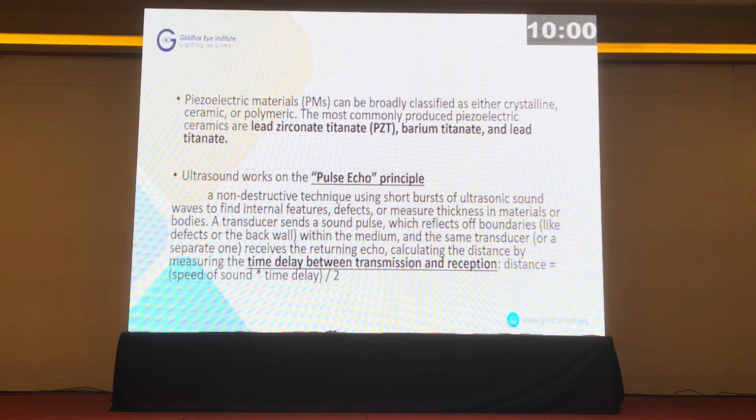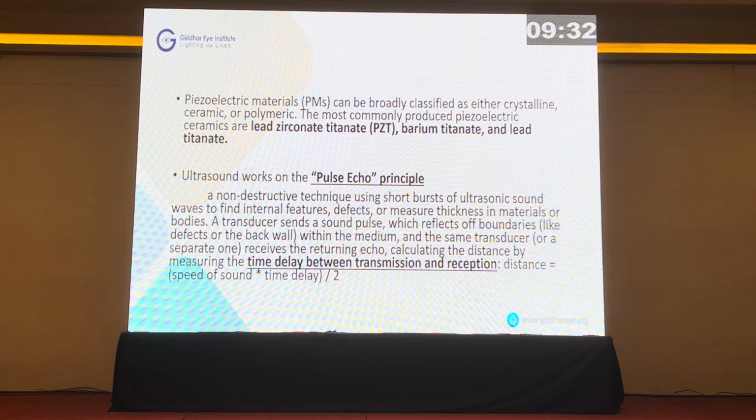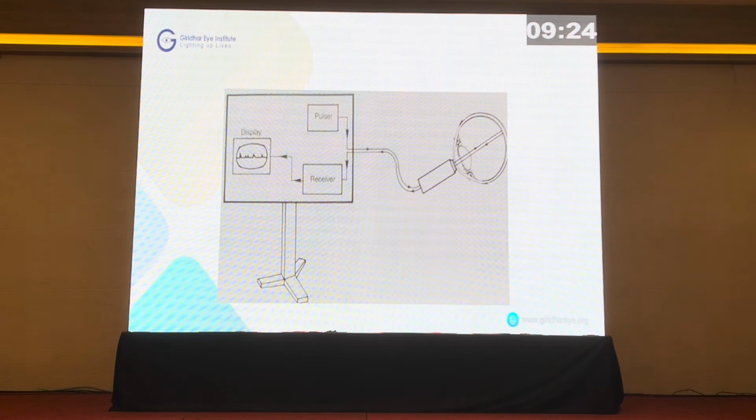The initiation of the signal starts with the use of piezoelectric materials, which most commonly used are lead zirconate titanate, barium titanate, and lead titanate, and it works on what is known as the pulse echo system. It locates a particular lesion inside the eye based on the time delay between transmission and reception. It is something like the Michelson interferometer, but instead of light, it uses ultrasonic sound waves.